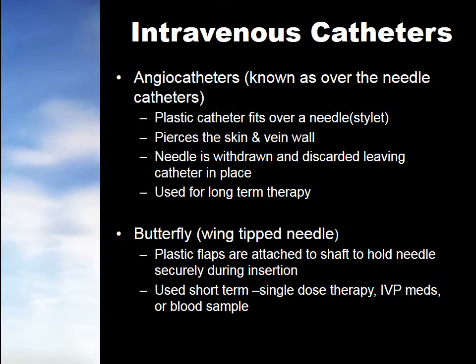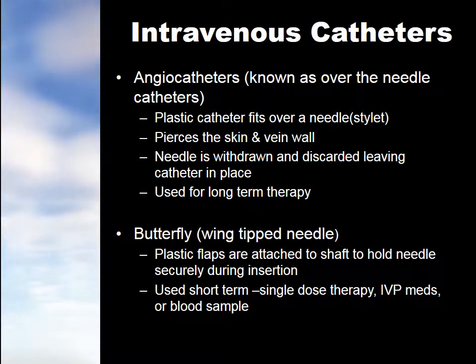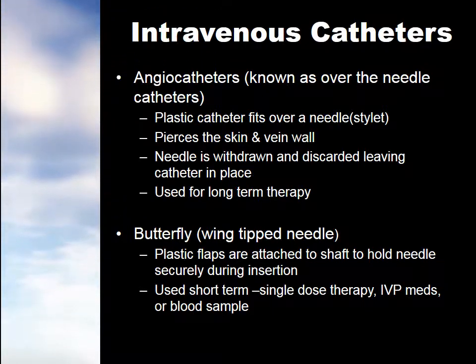The butterfly, which is the wing-tipped needle, has plastic flaps attached to the shaft to hold the needle securely during insertion. This is used short-term for single-dose therapy, IV push medications, or blood samples.